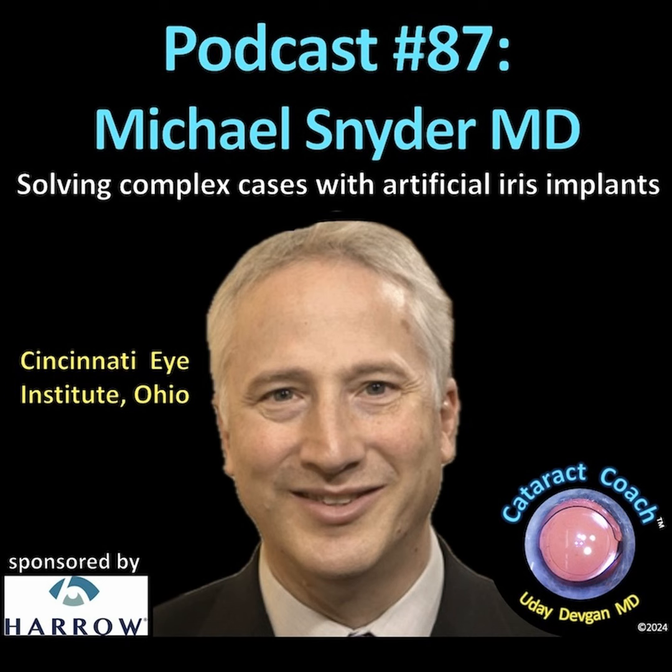The interesting thing is, it turns out it's easier and faster to suture them separately by about 20 minutes. You wouldn't think so. It's counterintuitive, but I've done a bunch in every way. And it turns out it's actually just easier and faster to put them in separately, sequentially, using the same sclerotomies and using the same incisions. There are still some instances, though, where I will suture the device to the back of the iris.